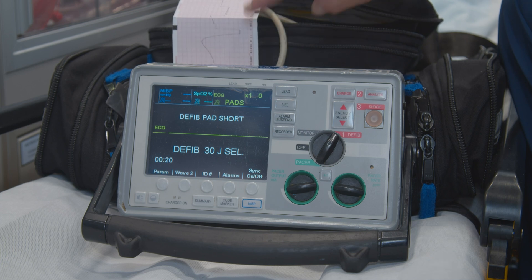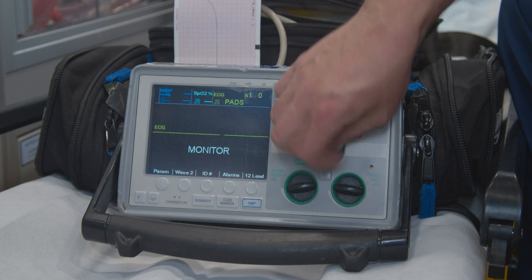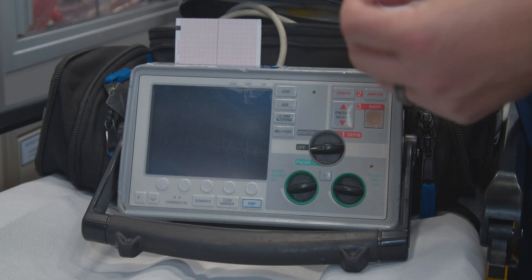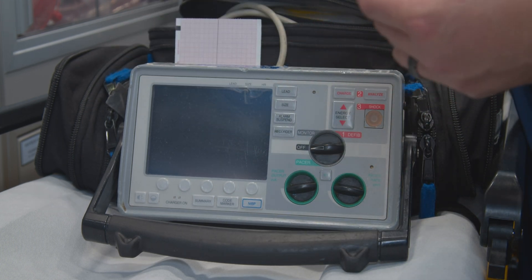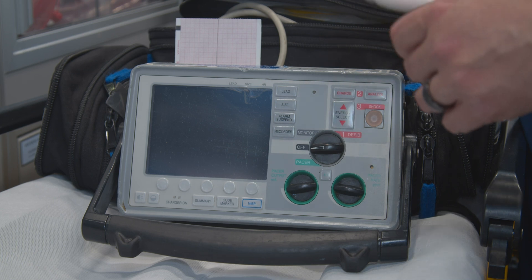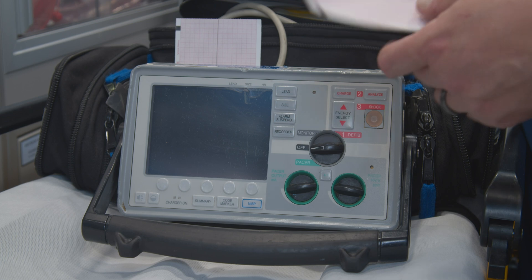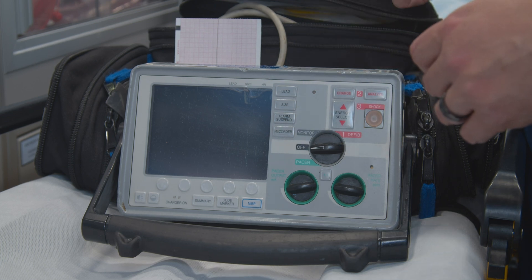Once you have the defib on your strip, go ahead and click off your monitor and then tear this. Keep this with you till the end of your shift. Then you can go ahead and throw this away.